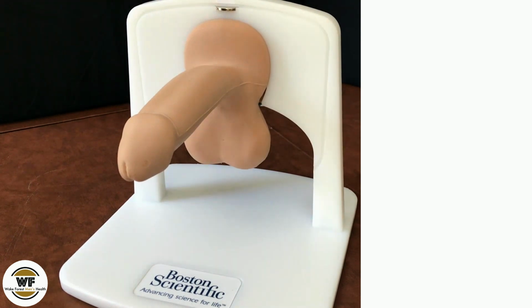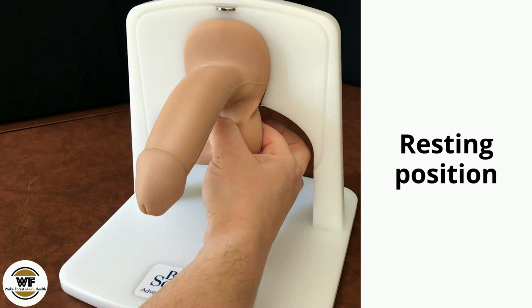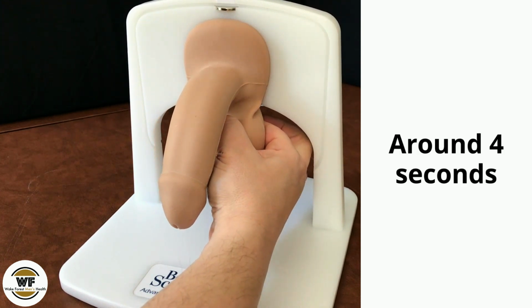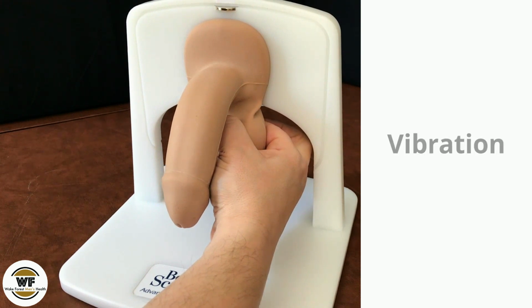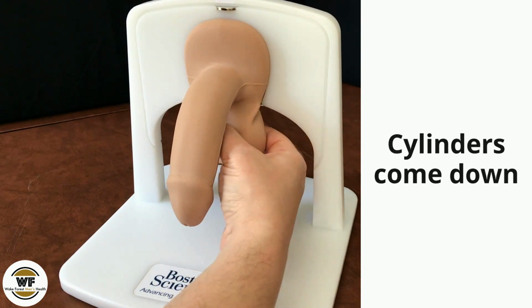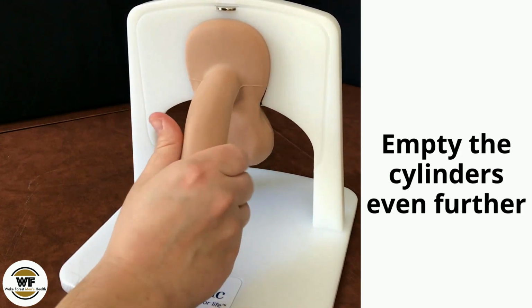Now, let's go over how to put the implant back in a resting position. The thumb on the small circular button and finger behind is pressed together for around 4 seconds. You can often feel a vibration in your fingertips from the fluid going back to the reservoir as the cylinders come down. After letting go of the button, you can use your hands to empty the cylinders even further.